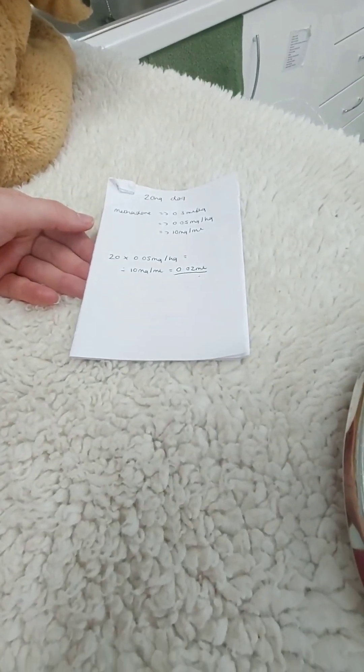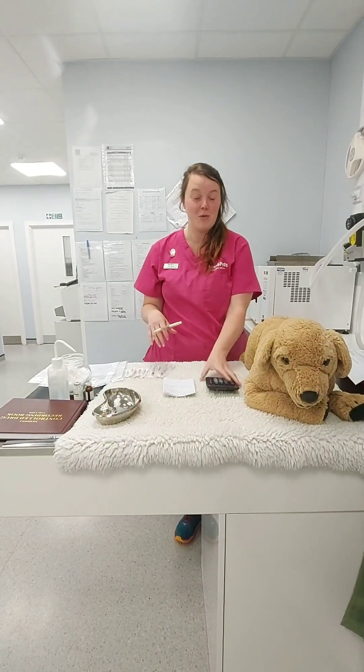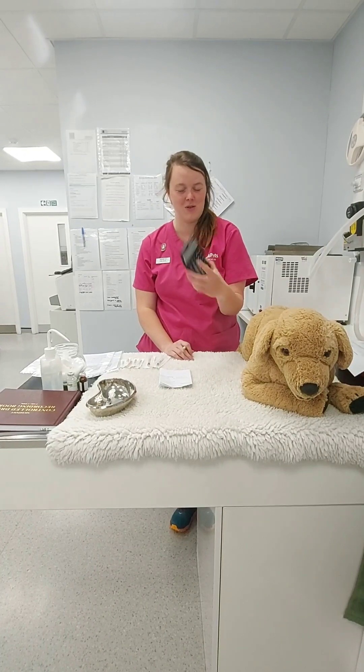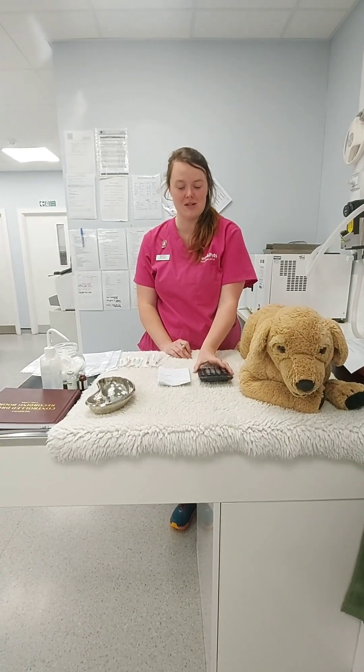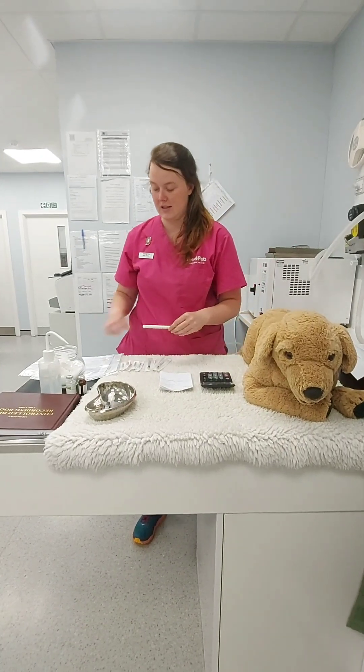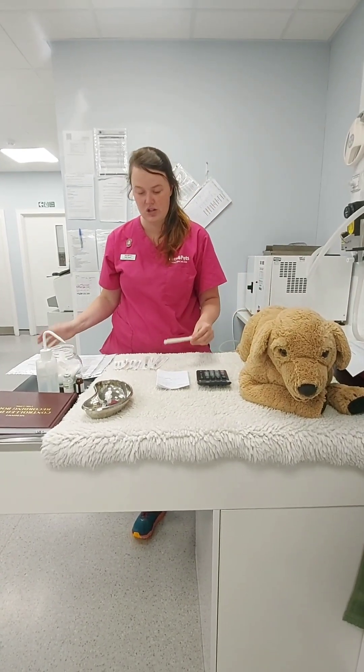For this circumstance we're going to do 0.02 mls. I've recalculated with a calculator — ill-advised not doing that — and it's actually 0.1 mls, so that seems like a more practical number. So we're going to do 0.1 millilitres and can then go on to constructing our needle and syringe.